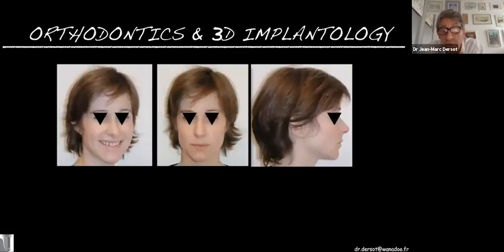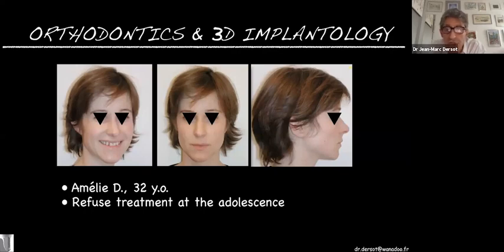Just have a look at a clinical case associating orthodontics, implants, and prosthetics. A young lady, 32, she or her parents, I don't know exactly, refused the treatment when she was an adolescent. So now she's a little worried about the hole in her denture. So the main motivation is an aesthetic one. I will tell you when I received this young lady in my clinic.